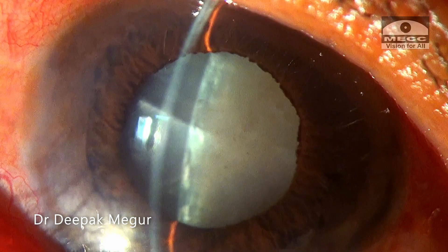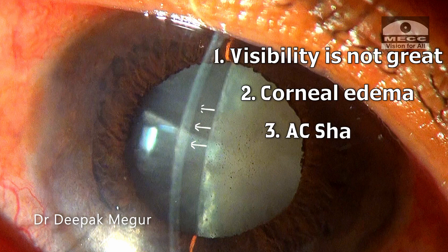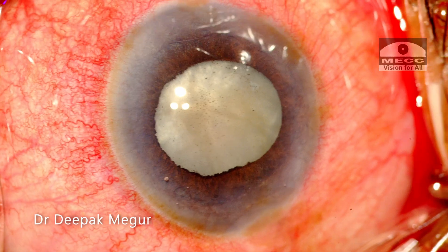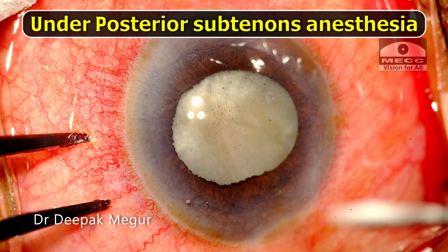There are multiple challenges to deal with in this situation. The visibility will not be great because of the corneal edema. The anterior chamber is extremely shallow. The rhexis is going to be challenging because the intumescent lens and nucleus could still be dense. The surgery is being done under posterior sub-Tenon's anesthesia.